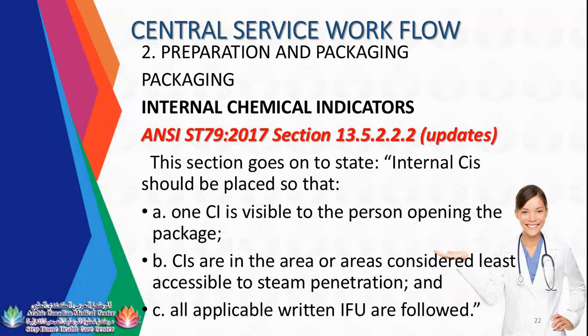Chemical indicators are placed in the area or areas considered least accessible to steam penetration, and all applicable written IFU are followed. In CSSD, guys, the IFU, or instructions for use, or medical device instruction, is very important, because every instrument, as I said, has a different approach. Every machine has different procedures on how to operate them. Every instrument has different procedures or protocols on how to clean them. So you need to check. It is important to check the IFU. If in your exam it shows a written IFU, it is the first answer.